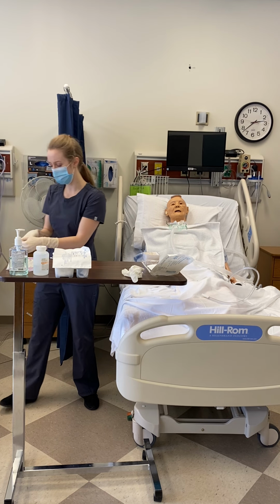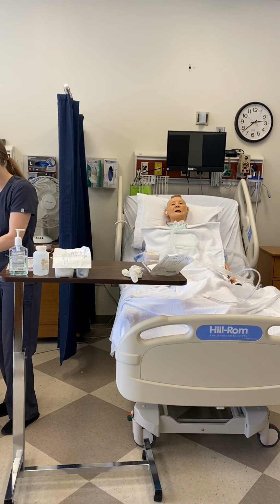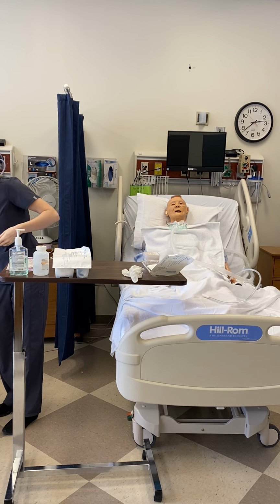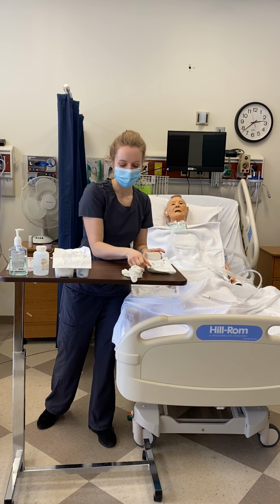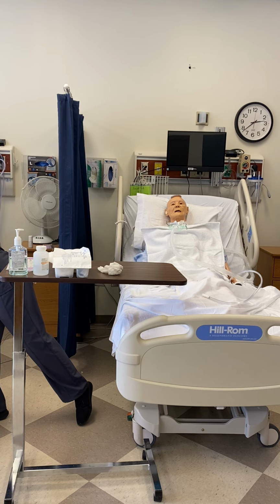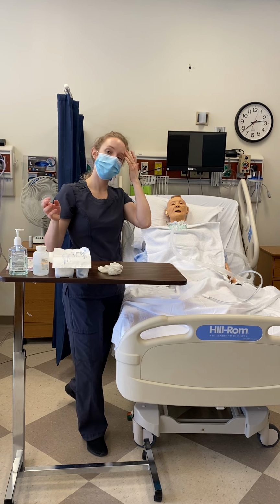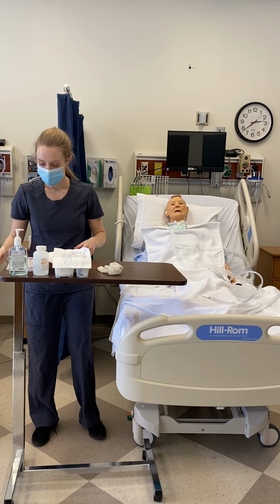Wrap this up in my glove and discard it. Perform hand hygiene. And clear my workspace for my next step, which is to provide trach care for Mr. Smith.